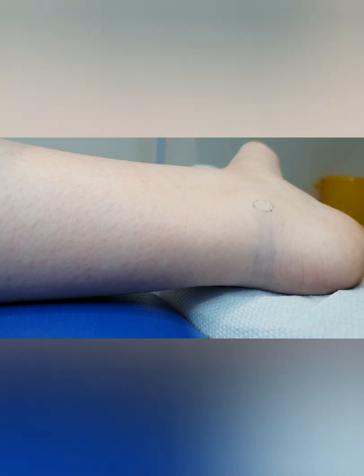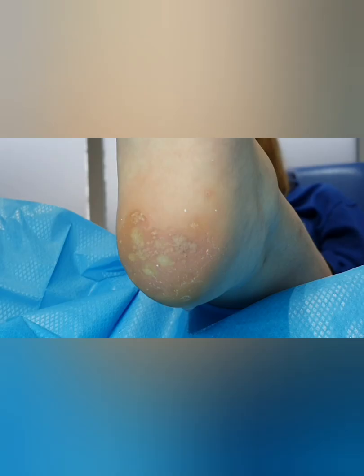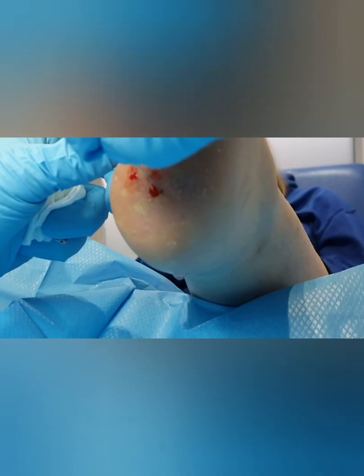So that's the injection done. Now we wait for it to go nice and numb. This lady is suffering with verrucas on the heel of her foot. So here they are before we've taken the callus off, and here they are after the callus has been removed, so we can see what we're doing. Now it's nice and numb, we're going to start needling it.